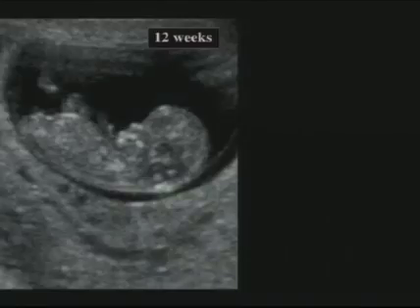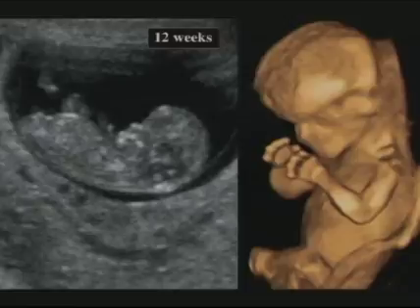At 12 weeks, we get a lot more surface information about the fetus. You can see the digits, you can see the eye, you can see a lot of details, better than you can see them in 2D.